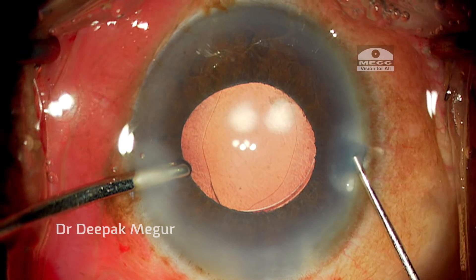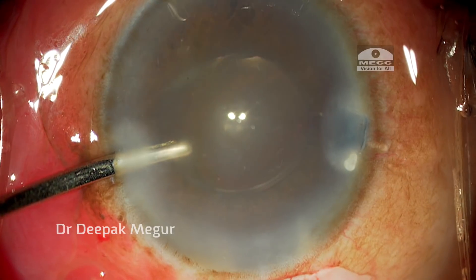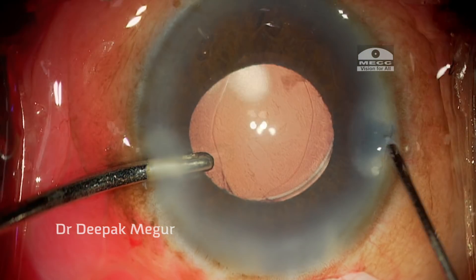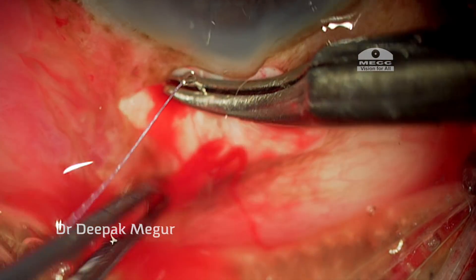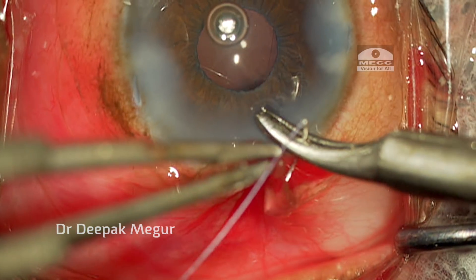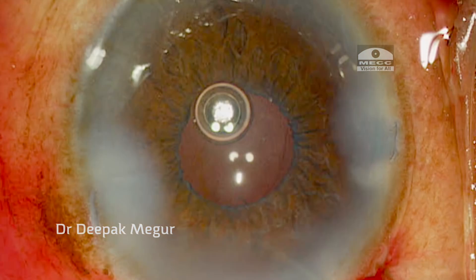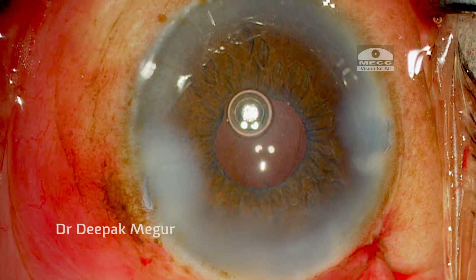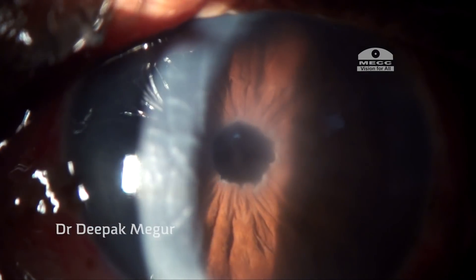I inject a little pilocarpine and confirm the absence of vitreous by using triamcinolone acetonide, then hydrate the wound. I use 8-0 Vicryl to close the sclerotomy, then close the conjunctiva and the case is done. The next post-op day, as expected, there was some amount of corneal edema, but eventually it cleared off and the patient did well.